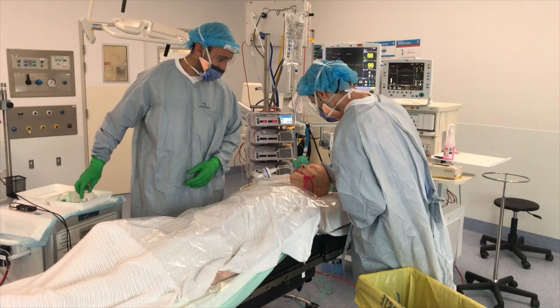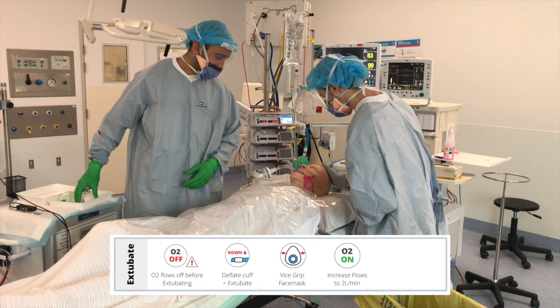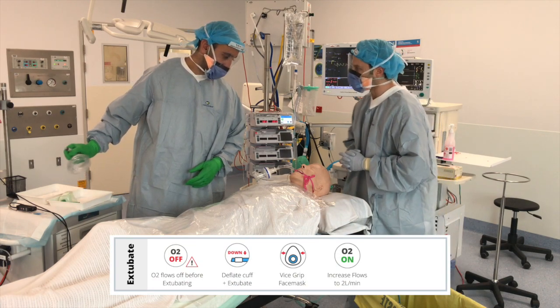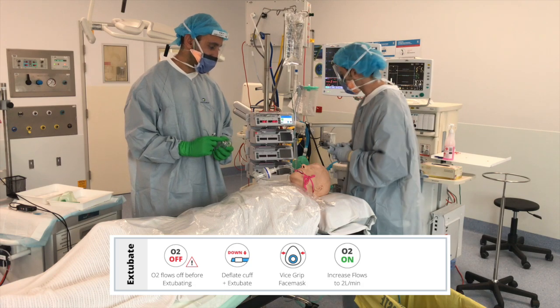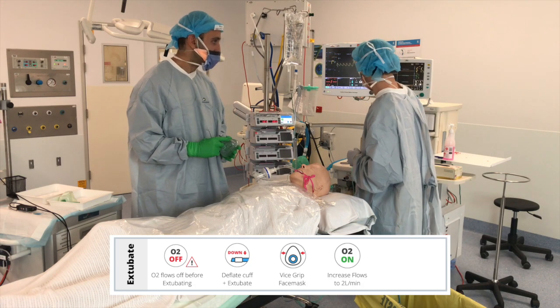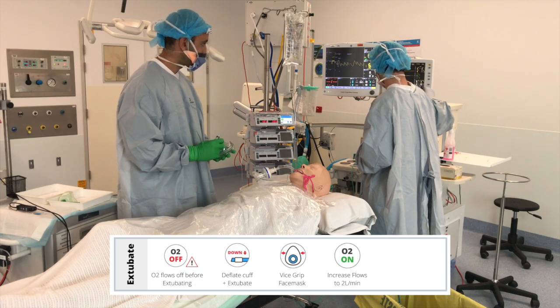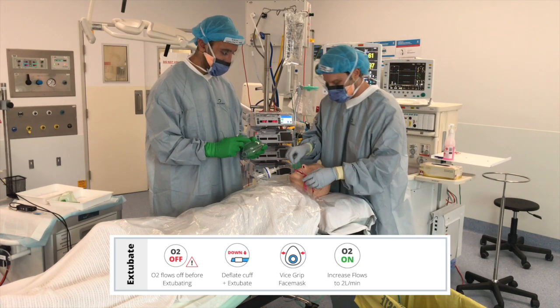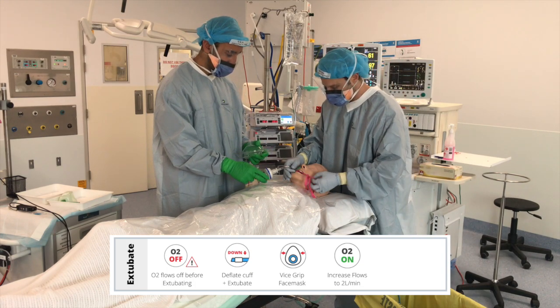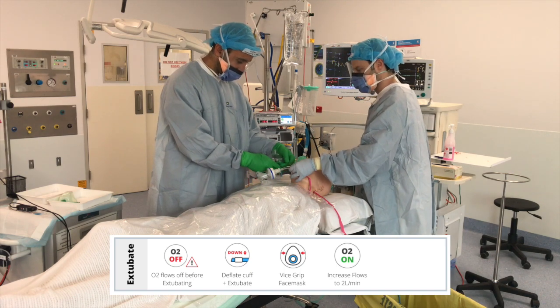Jeff, how are you going there? Can you open your eyes? Great. Take a deep breath for me. Fantastic. Okay, so I think he's about ready for extubation. Are you happy? Yep. Okay, so we'll turn the flows off. Flows turned off. Flows coming down. Got our mask ready. Yep. And the pump is a few times. You can get ready to gently take the cuff down.